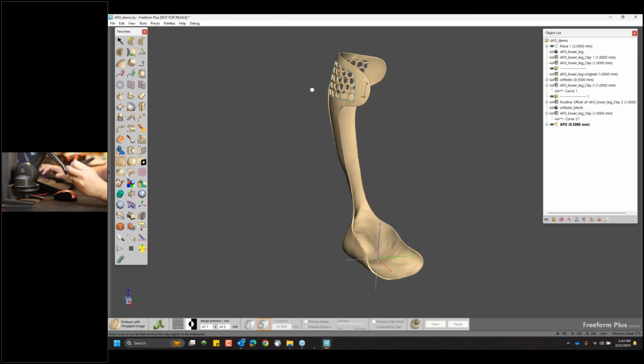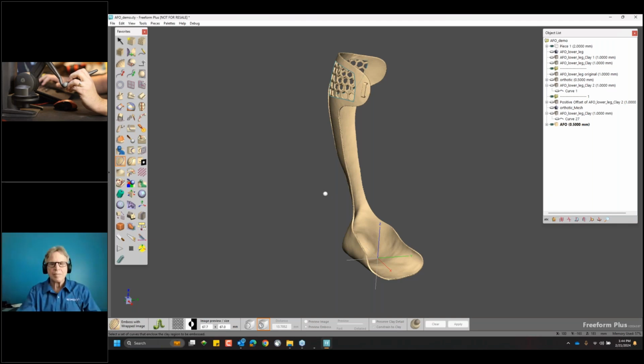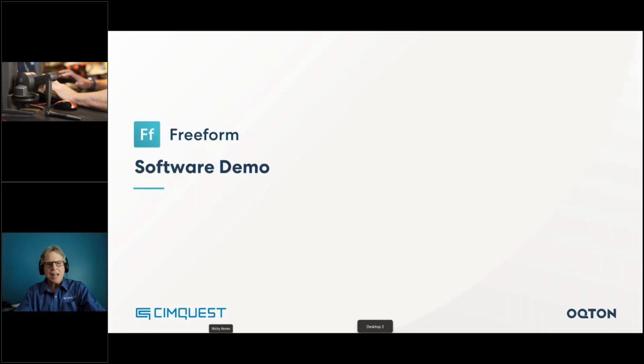So this is where I will end the demonstration. So we still have time for question and answer here at the end. Hey, thank you so much. That was an awesome job.